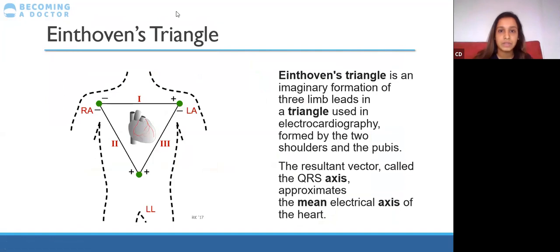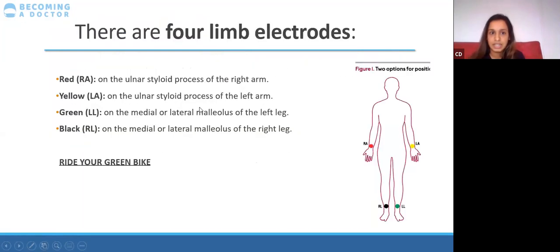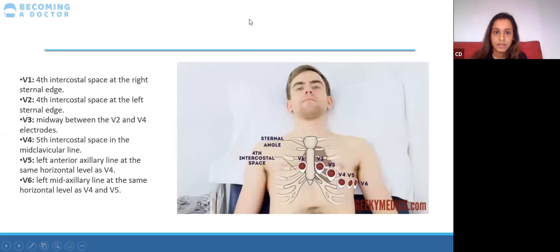Can you go over the placements of where they are on the heart again? As in where they are on the heart, or where they go on the chest? So the chest lead placement. Okay, I'm just going to assume you mean the chest lead placement, but that's this slide. I'm sure you'll have access to the slides later as well if you want to check, but this is from Geeky Medics, and they also have a video of how to do an ECG, so watch that if you're confused about where the chest electrodes should go. Are there any more questions?